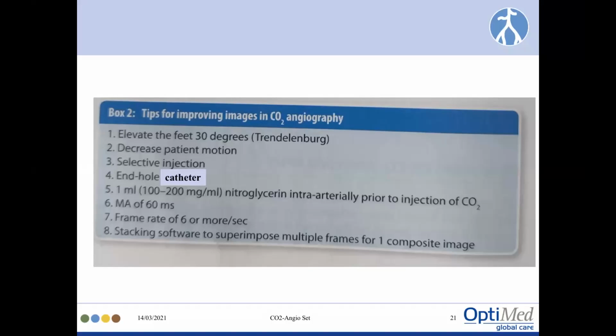It's better to sedate the patient a little bit, because when you are doing CO2 angiography for the first time, what strikes you is that my DSAs used to give me such beautiful, brilliant pictures, and this doesn't look as brilliant. That is some kind of a mindset that you need to slowly get used to, because we are treating patients who really can't get the contrast. And so sometimes you need to cut a little bit of corners while you're doing carbon dioxide in terms of the brilliant pictures that you get.